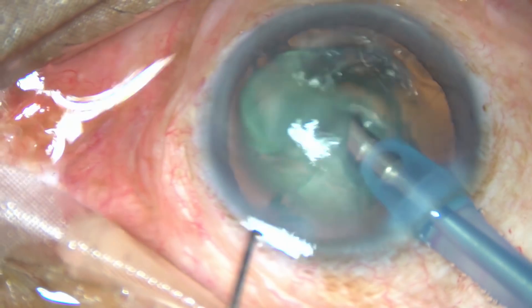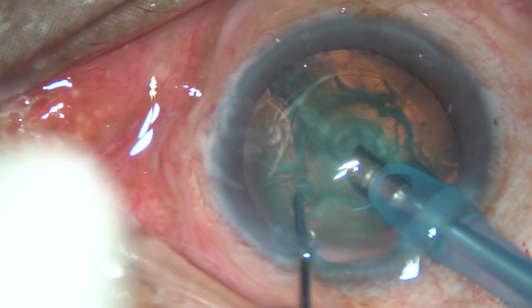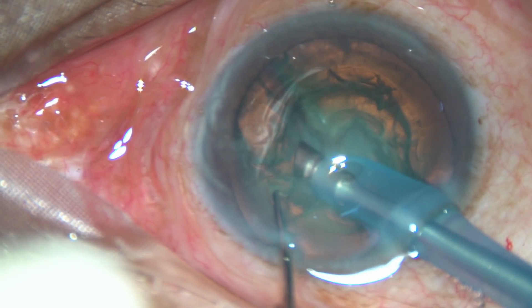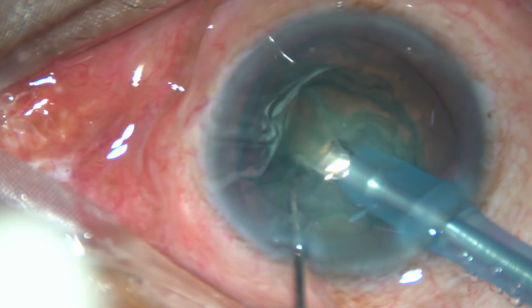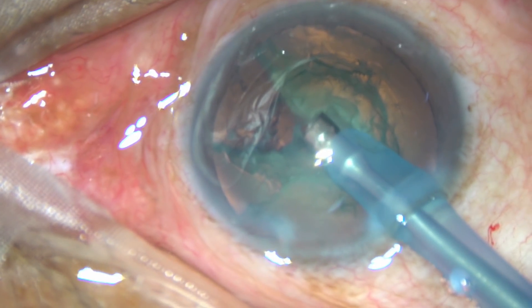Turn the tip towards 3 o'clock. Hold the nuclear mass firmly and chop it. You will find a free nuclear fragment — remove it and make this space.